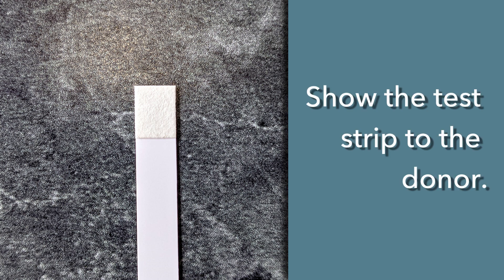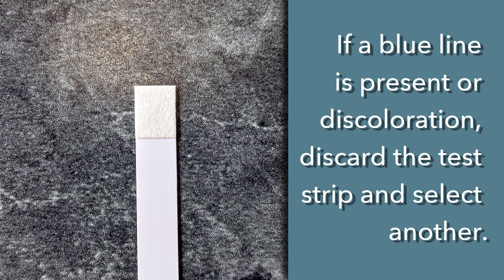A faint shadow of a line may be seen. This is acceptable as long as the line is not blue. Show the strip to the donor. If a blue line is present or if there is discoloration on the test strip, discard the test strip and select another.